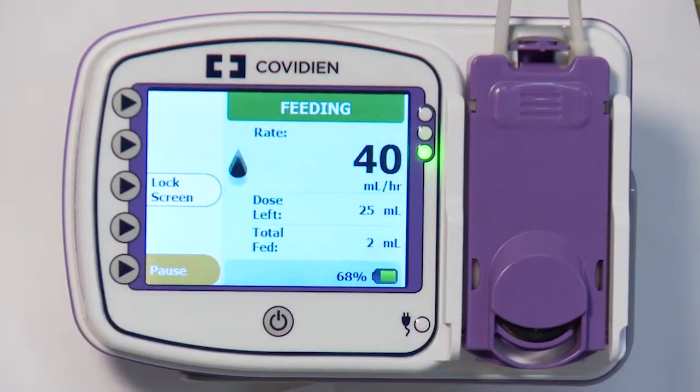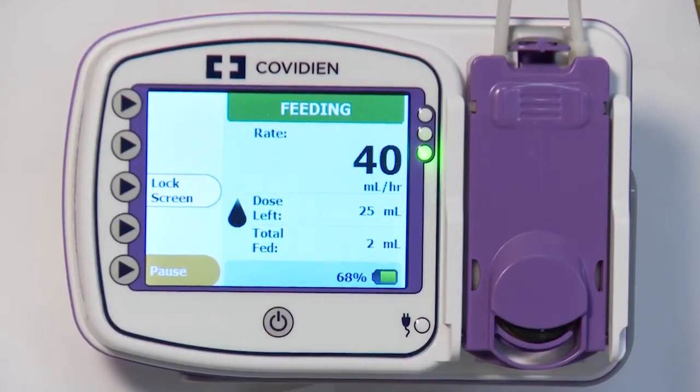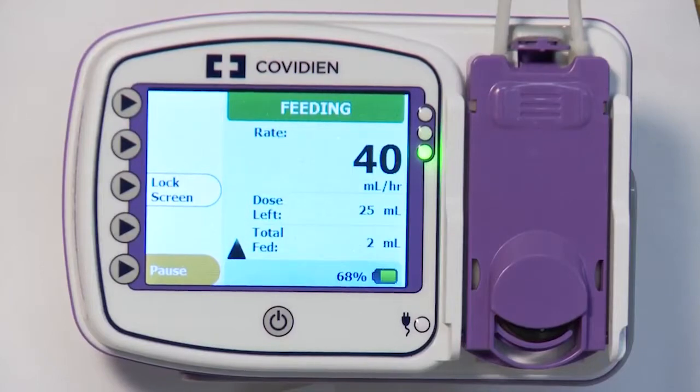If the Adjust Dose button does not appear, you will need to enable the Dose feature. See Advanced Settings to enable the Dose feature.